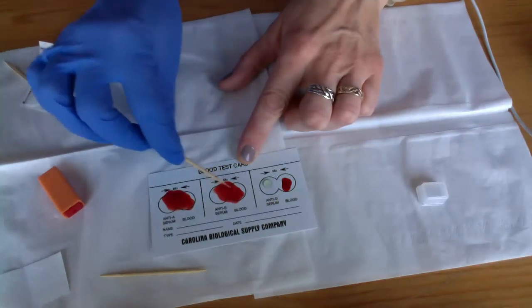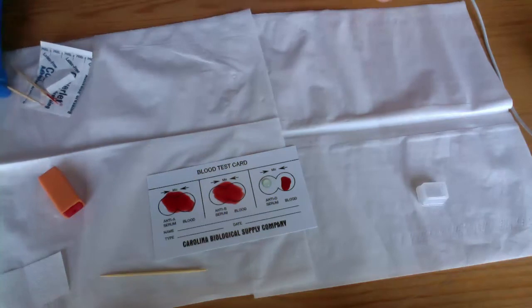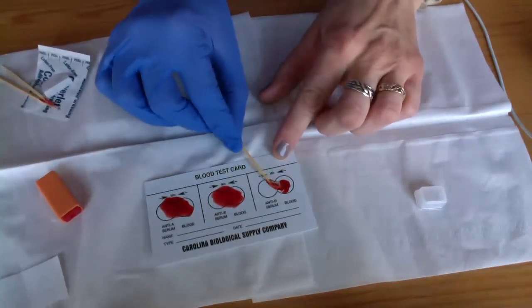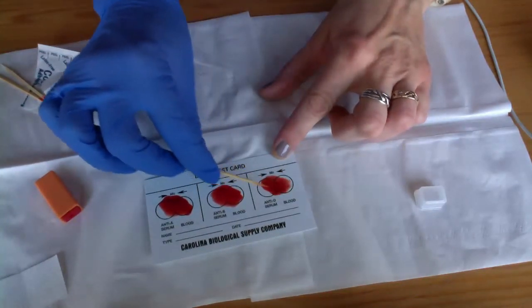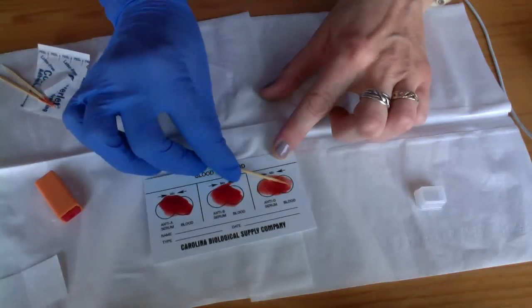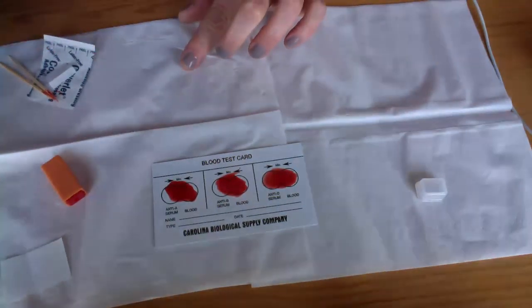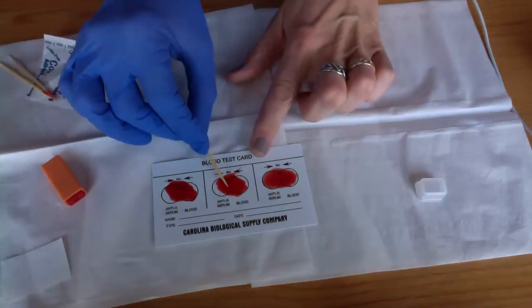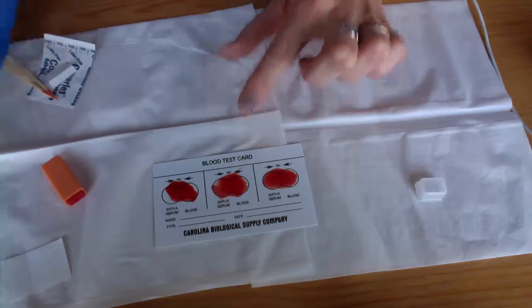I happen to know my blood type, which is kind of nice ahead of time. Some of you may know your blood type if you've donated blood before. Okay, and here's the anti-D. Sometimes it actually helps if you spread your blood out a little bit, so I'm just going to spread this one out so you can see that one a little better.